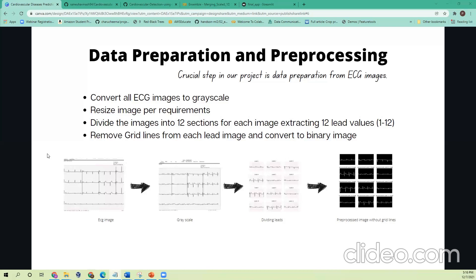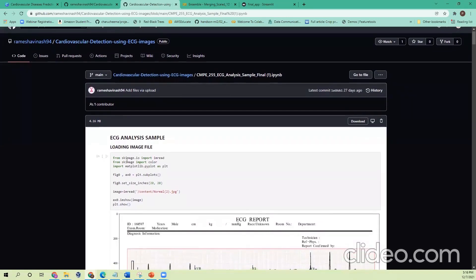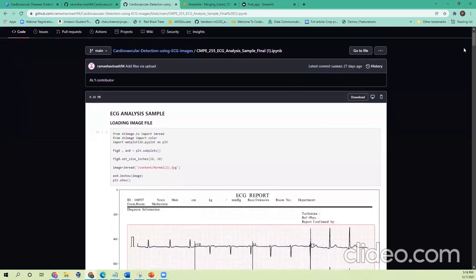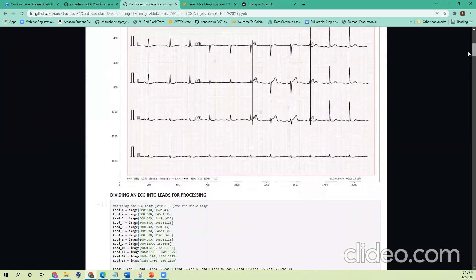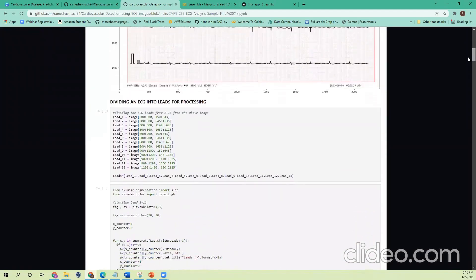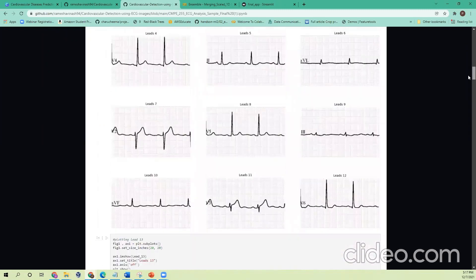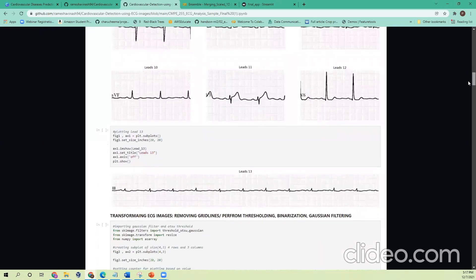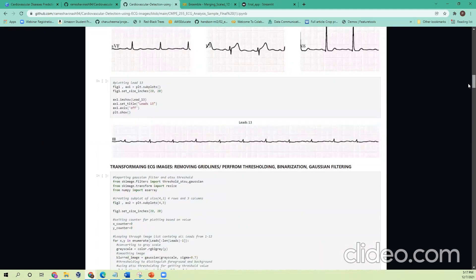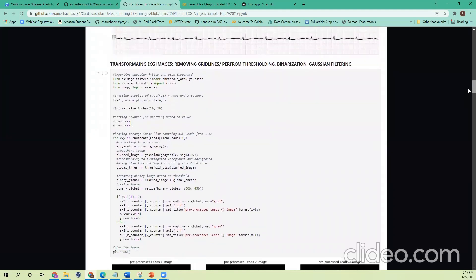Let me showcase a Colab notebook for a basic understanding of all the steps. Here is the first initial Colab that we worked on. At first we are reading an ECG image, then as I said we divide the image into 12 leads and store them in a list for processing. We had 13 leads in place, but we use only the important ones — the long lead is not considered for our process.